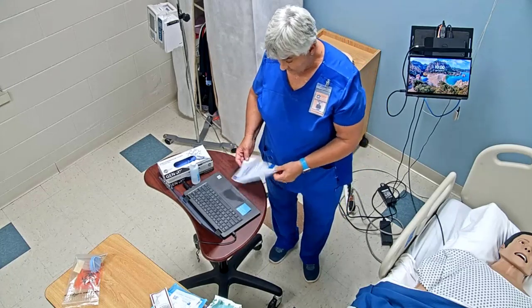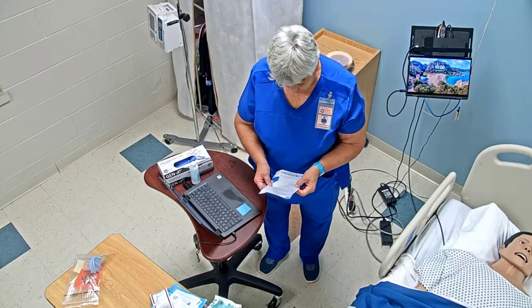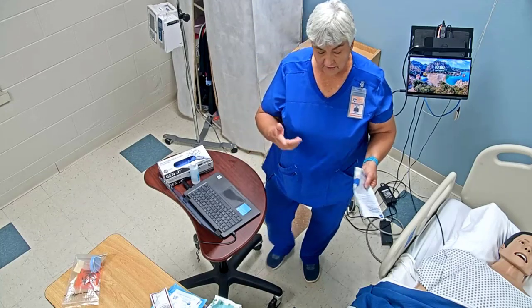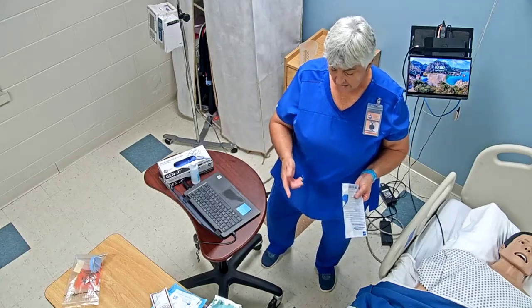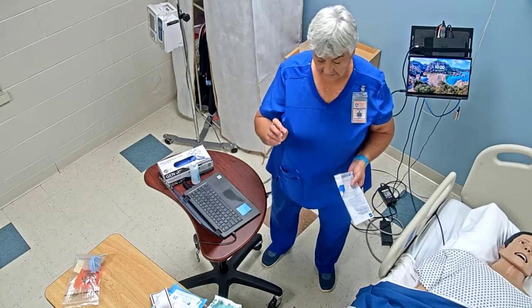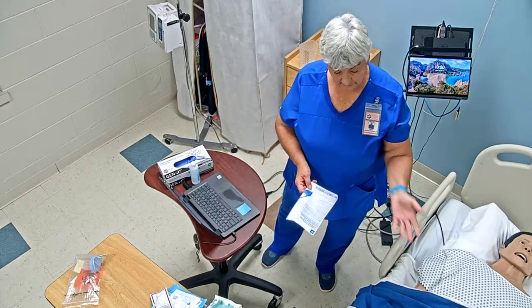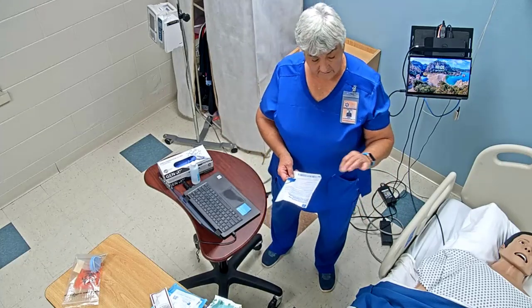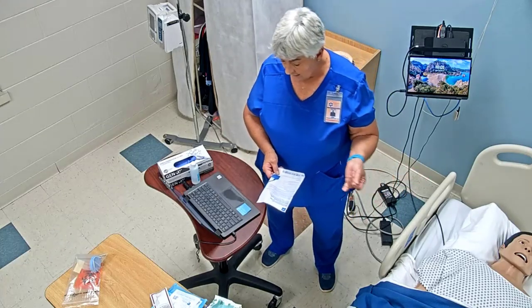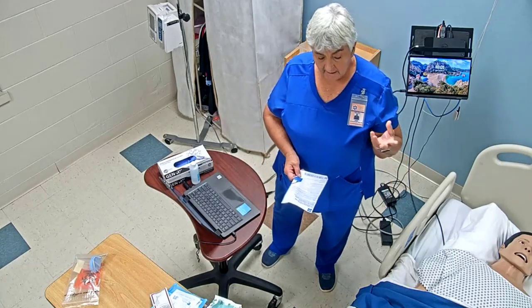And so we're going to be looking at the type, okay, what type of catheter, the size, which was the 14 French, the color and the consistency, which was light yellow, it was clear, and it didn't have any odor. Number of insertion attempts: in this case, we just attempted one, and sterility was maintained during the procedure.